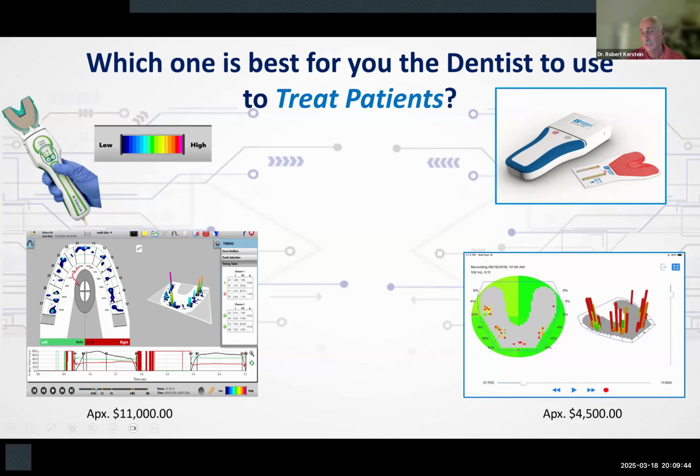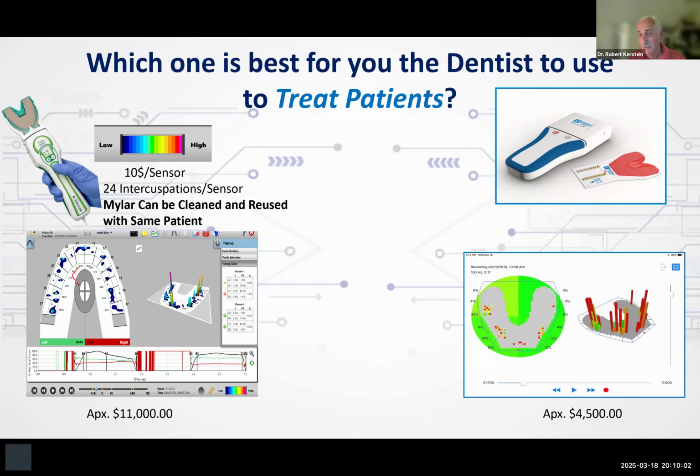So first, it's important that you understand T-scan sensors, which are mylar encased and hold up very well to repeated intercuspations. They can be used about 24 times without cracking, and they cost about $10 per sensor. And because they're encased in mylar, they can be cleaned and reused with the same patient.